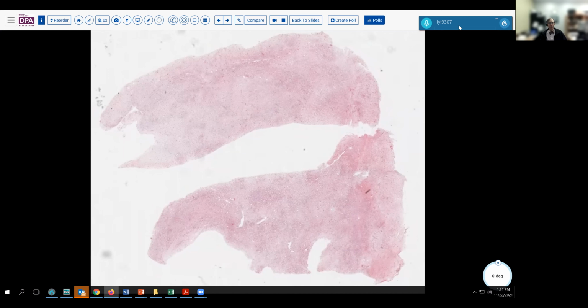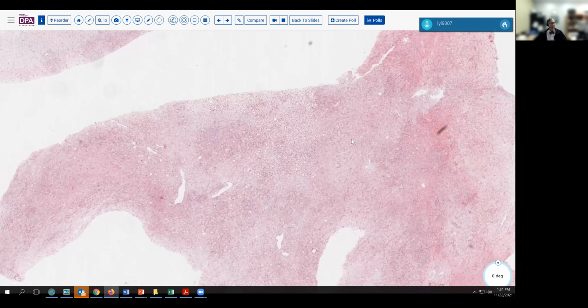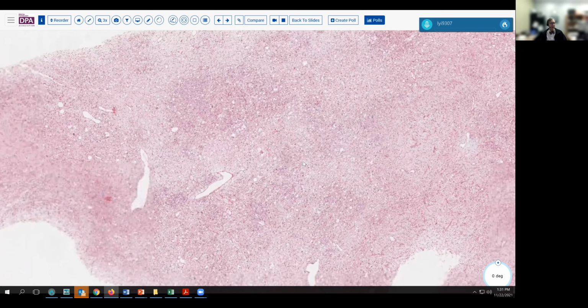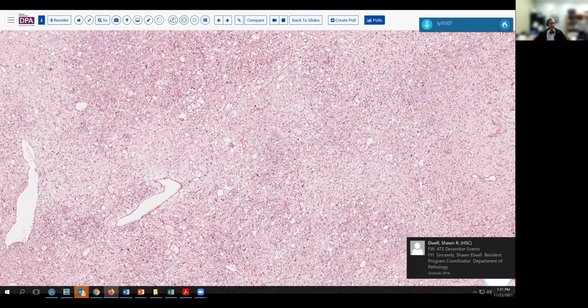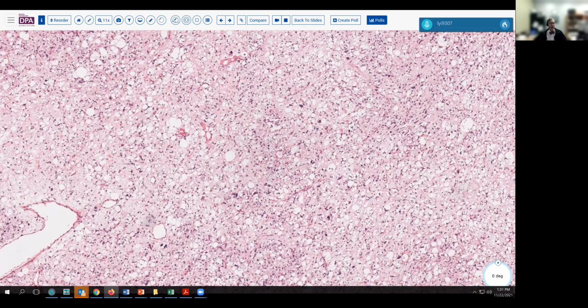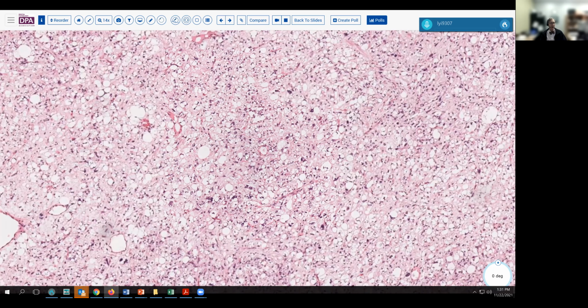This is a tumor that also might be called pleomorphic liposarcoma. And I present it to show you a little bit more of the diversity of morphology. So as you can see here, this case has some degree of nuclear pleomorphism. You can see variable nuclear sizes even here at intermediate magnification. And there's a lot of clearing to the cytoplasm, which is, as we come into higher magnification, characteristic of this almost exclusively lipoblastic appearance in this tumor.